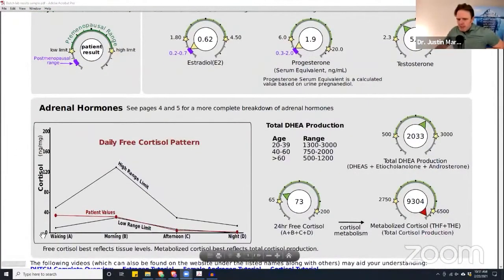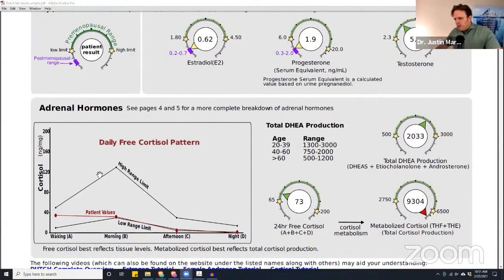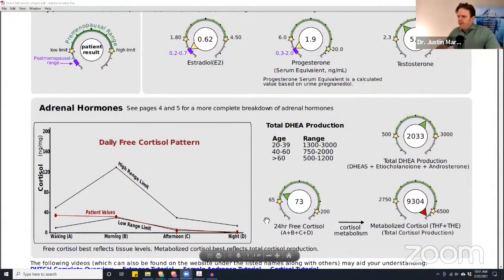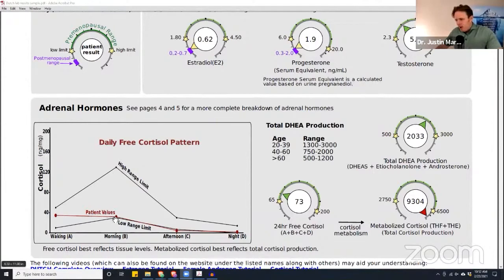This is our cortisol pattern, our daily free cortisol pattern. You can see you wake up here at A and your cortisol should taper up in the morning within the first hour and then go down throughout the day. This patient actually started with A here — this is cortisol with a pretty good rhythm out of the gates. But instead of peaking up 50-100% or so, they actually went down.